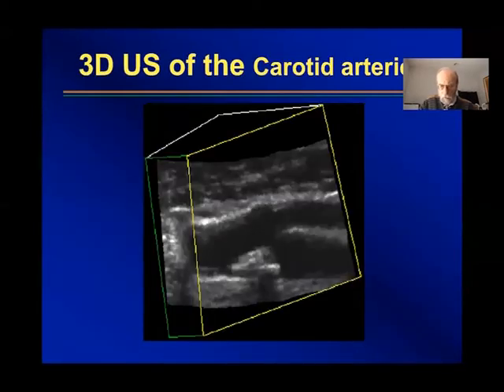Another technology we have developed is 3D ultrasound imaging of the carotid arteries. In this technology, we can image the plaques in the carotid arteries in 3D and measure their volume. And what's most important is being able to image these patients serially over years to see whether the therapy these patients are undergoing, the various medical therapy procedures, is working, so as to see if the plaques are stabilizing or in fact diminishing. So this technology has already been licensed to a company and is being used widely.